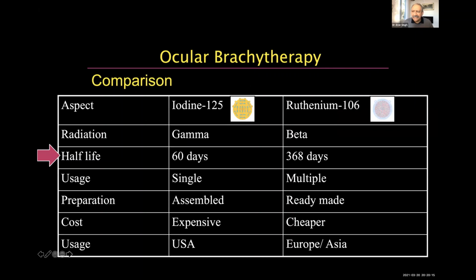And there's a reason, otherwise an economic reason: we know ruthenium works out cheaper if you use it multiple times. And it's easy to handle if you don't have elaborate departments of radiation physics. Then it may be a choice for you.